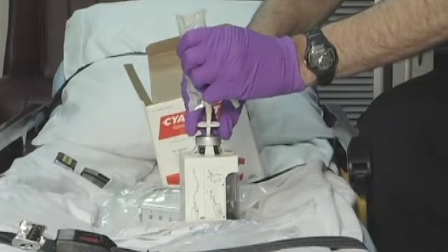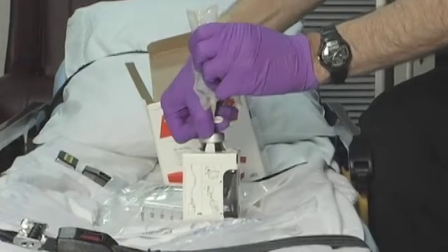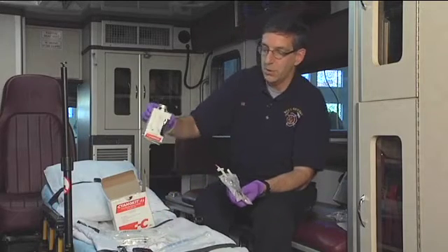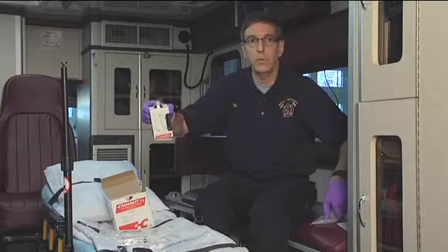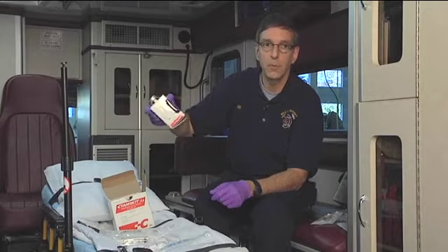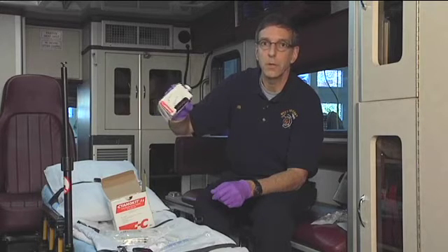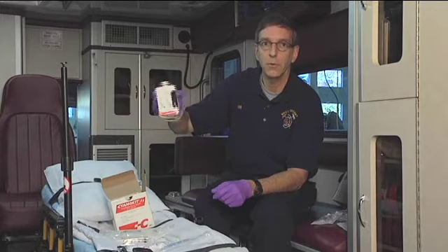Now we have all of the diluent into the bottle. We're going to pull the spike out of the bottle and we're ready to mix the medication inside. To mix it, be cautious because it tends to bubble if you shake the bottle. Instead, invert the bottle several times back and forth for about 30 seconds to completely mix the medication. Later on we'll take the bottle out of the box to look at what it actually looks like.